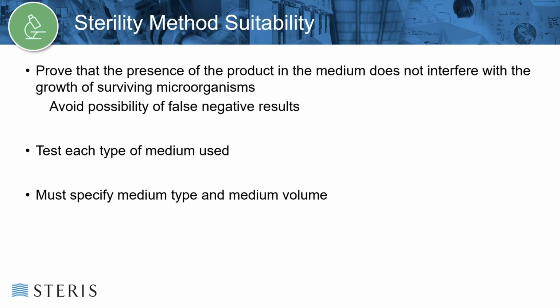We utilize 3 organisms per media type. Control samples utilizing the same type of test container and media volume are inoculated with the test organism as well. The positive controls and samples are then checked for growth within the required time frame.